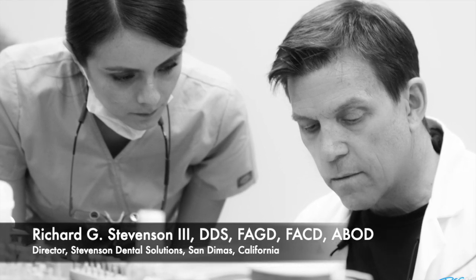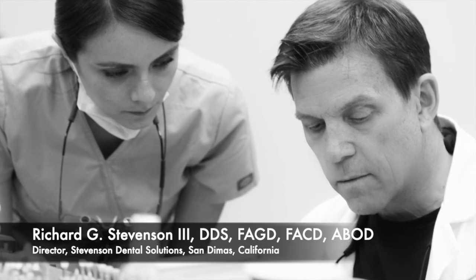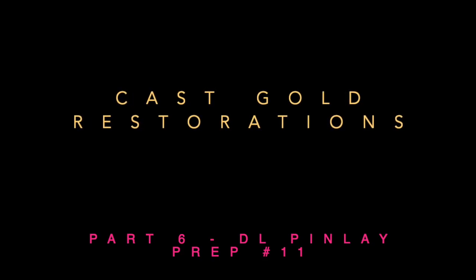We are a teaching center that focuses on hands-on courses to improve your skills and knowledge in general dentistry. Today, part six — the DL pin lay on tooth number 11.